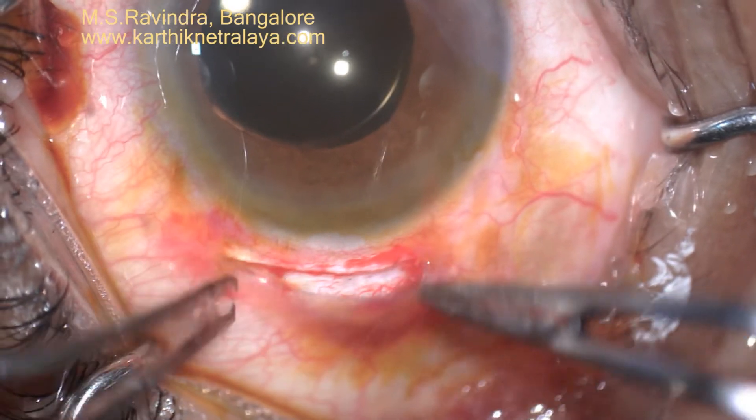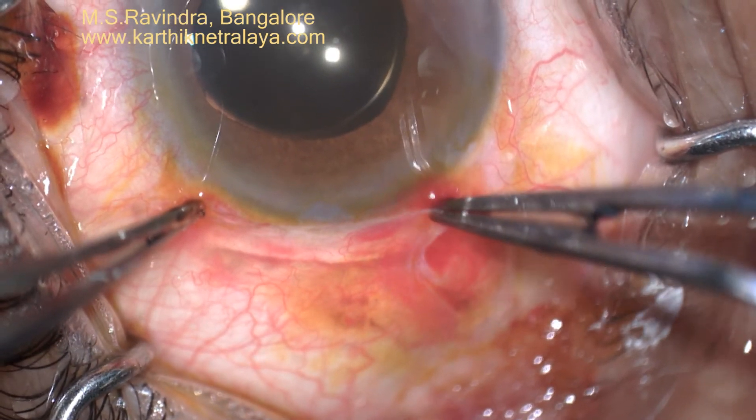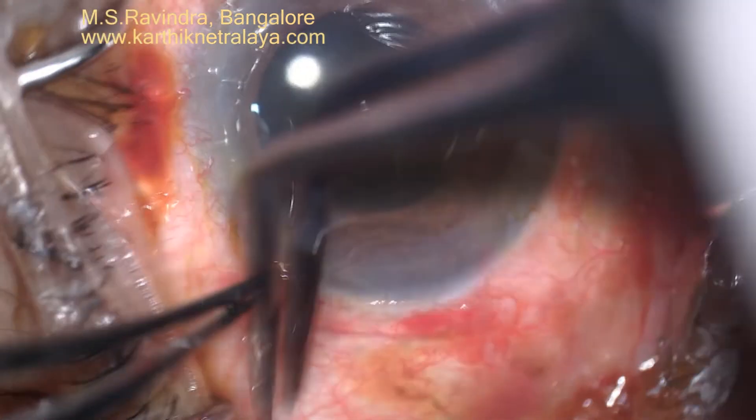The eye does not need bandaging and the patient can start using the eye immediately. The endothelium is maximally protected as adrenaline is not used in the anterior chamber.